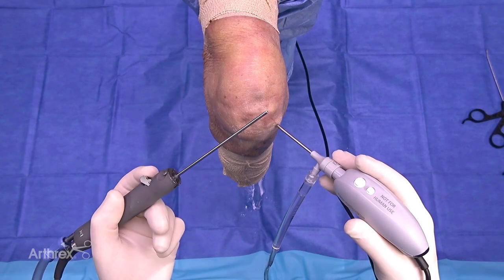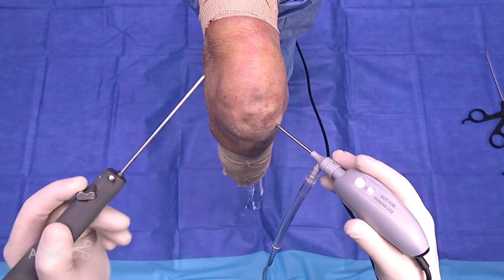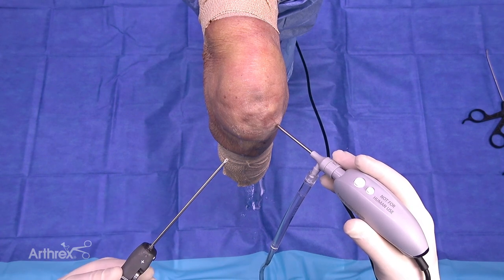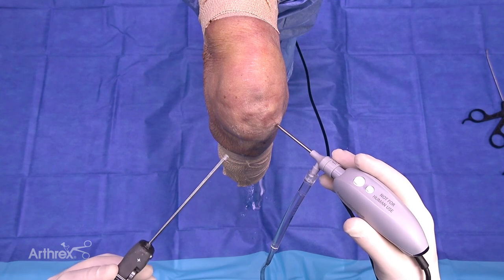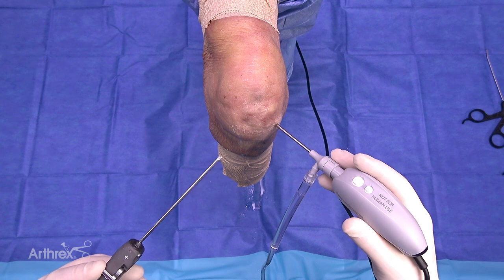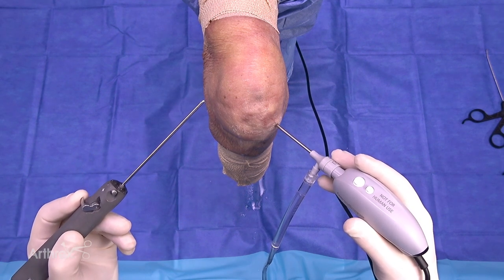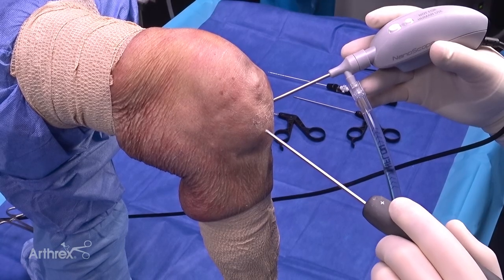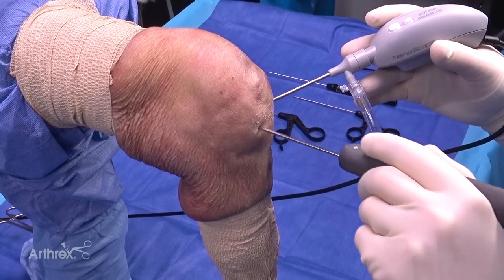Here we have our Nano Sabre, and we're going to introduce this into the joint. You can see how I'm holding it like a pencil — this is a very natural feel to it. The blade window is smooth for smooth edges. It's long enough that you can reach pathology in the back of the knee given that it's 11 centimeters in length, but it's also small enough that the incisions do not require sutures afterwards. You can't even see where I've made the small stab incision, but we'll be able to just push that right into the knee joint.